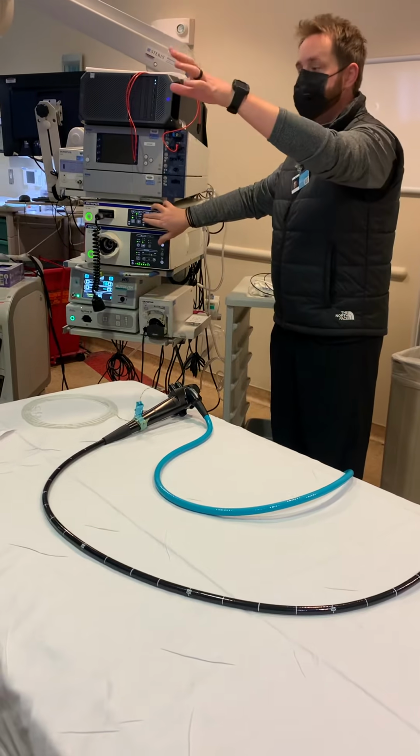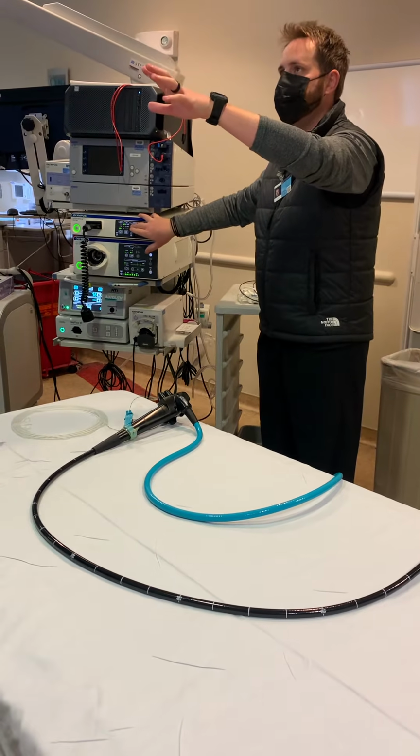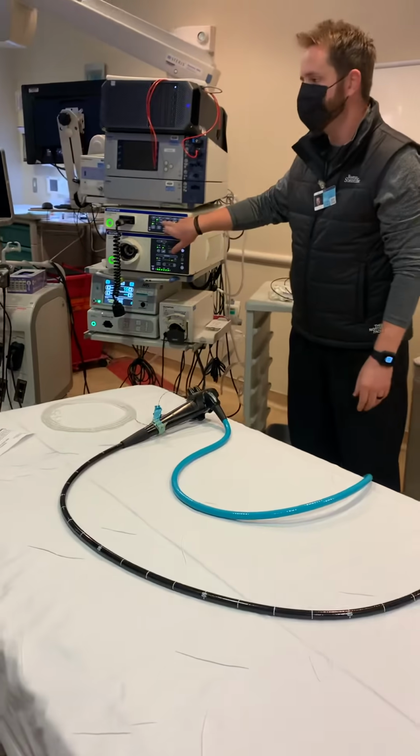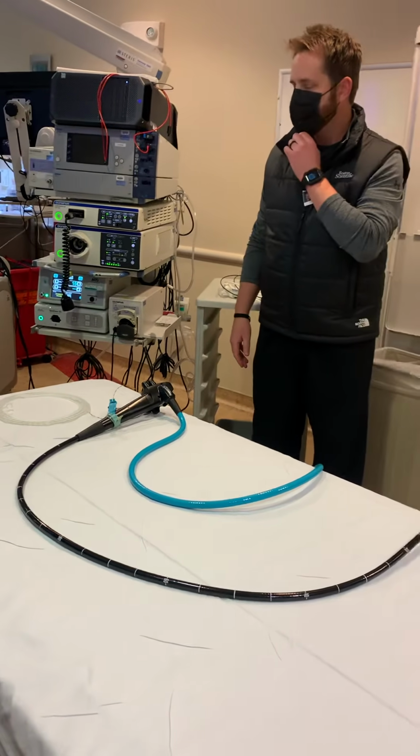And then make sure you see that Spyglass image in the corner like that. If you see it, then you know you can start the case, and then the moment the physician is ready to use Spy, all you do is turn on picture-in-picture, and there's your Spyglass image. Does that make sense? Yeah.